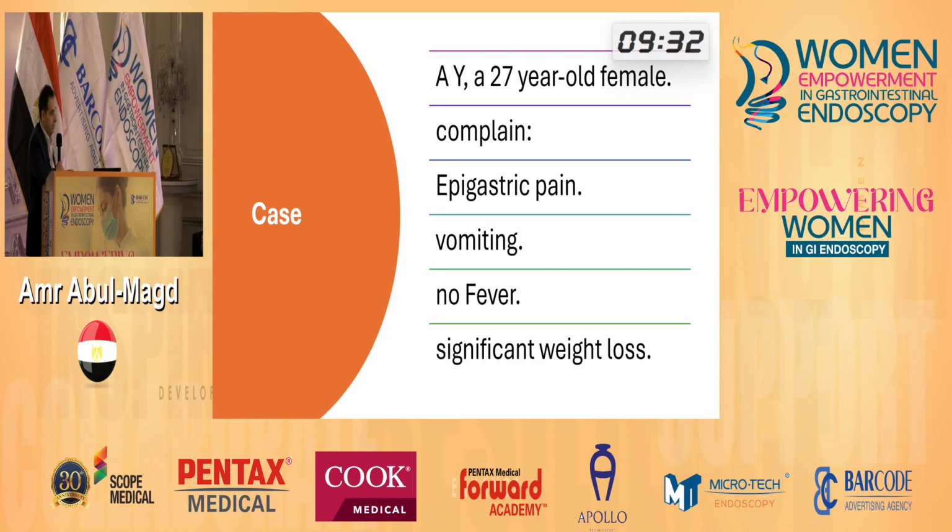I have a case that was transferred to me by one of my eminent colleagues for cystogastrostomy in a patient diagnosed with pseudopancreatic cyst. This patient was 27 years old, complaining of abdominal pain, vomiting, no fever, with significant weight loss. So we have a symptomatic pseudopancreatic cyst patient.